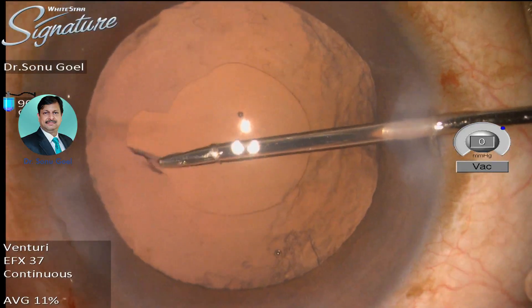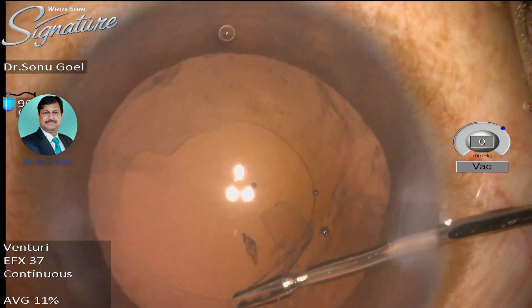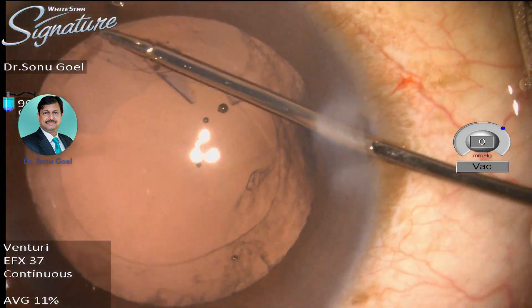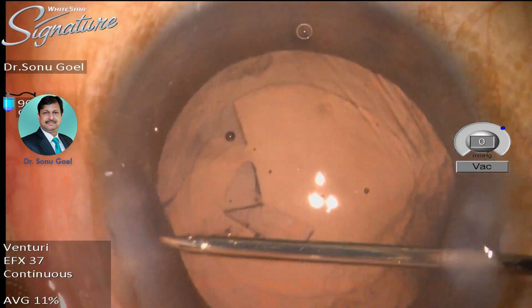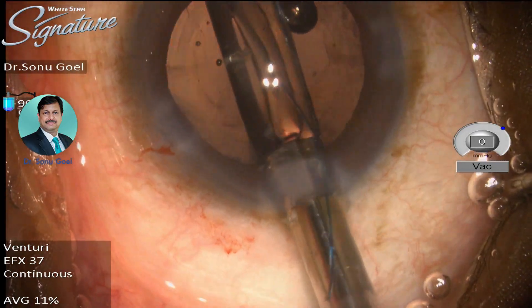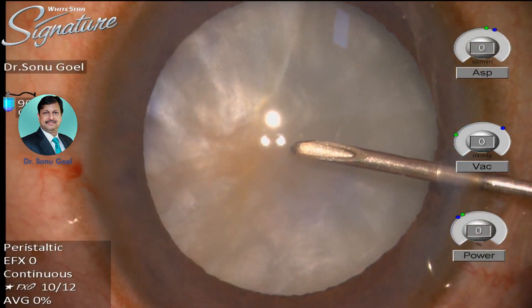Once phacoemulsification has been done, the rhexis can be enlarged — as shown here — using microrexis forceps from the side port and using high-density viscoelastic in the anterior chamber. This rhexis can be fashioned to give a cover of 0.5 mm all around the optics of the desired lens. As you can see here, the lens is well covered.